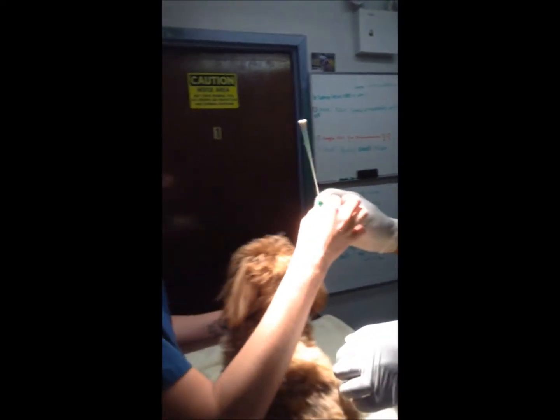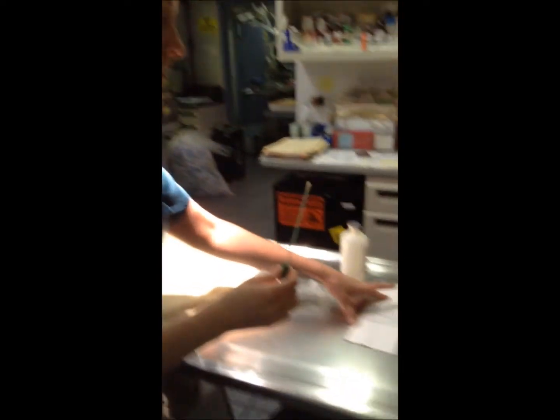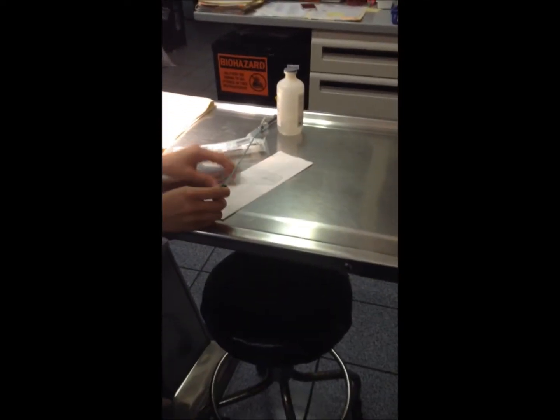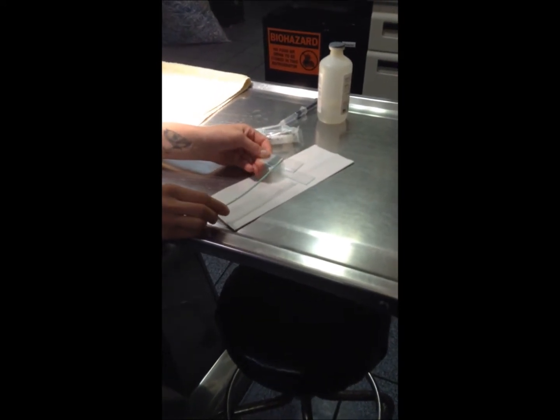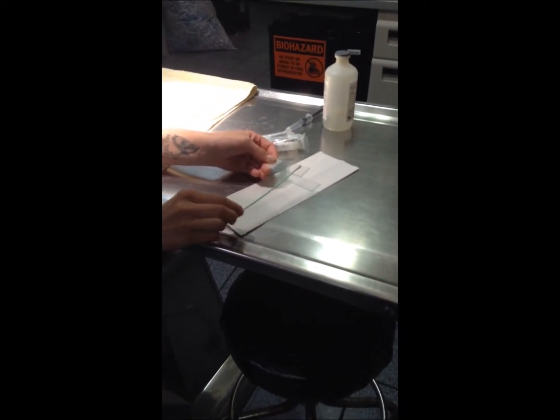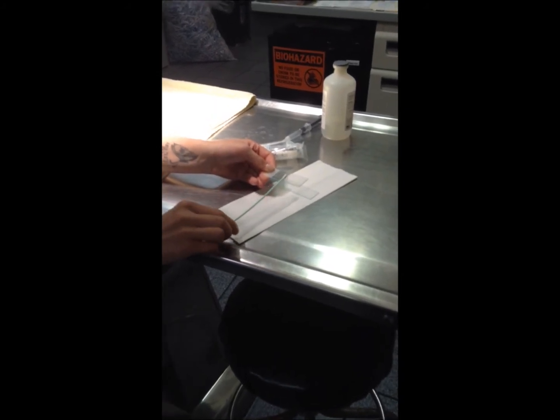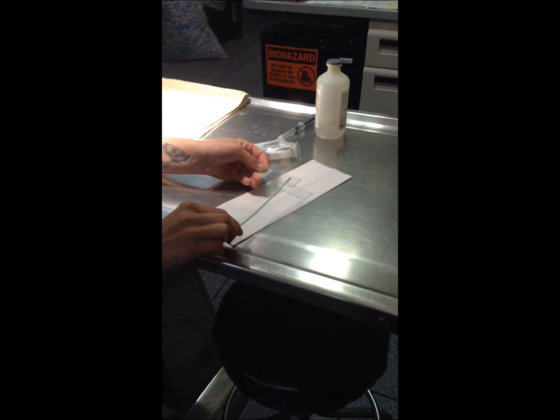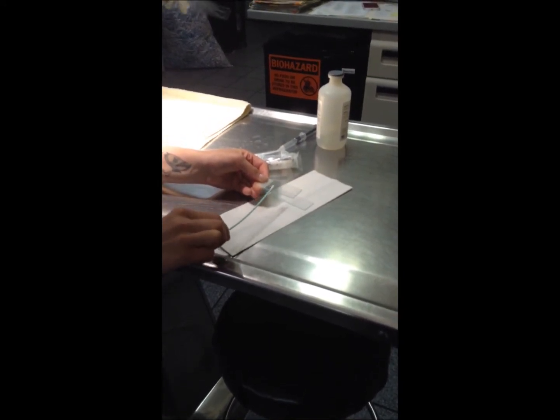There you go, Chris. And now I'm going to place this onto a slide so we can look at it under a microscope. Make sure the slide is nice and clean, and you're going to roll the sample onto the slide. And you always make sure that you label the slides with the patient's name and where it came from. Okay, we're good. You can take it.